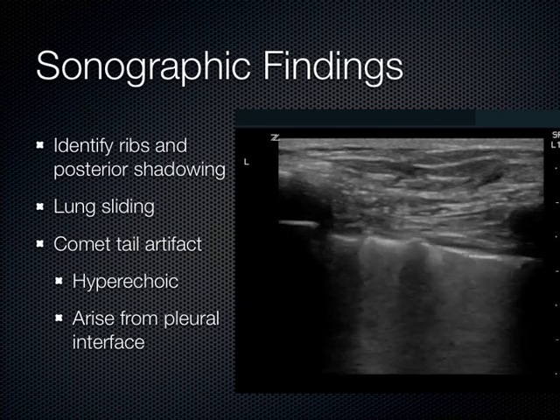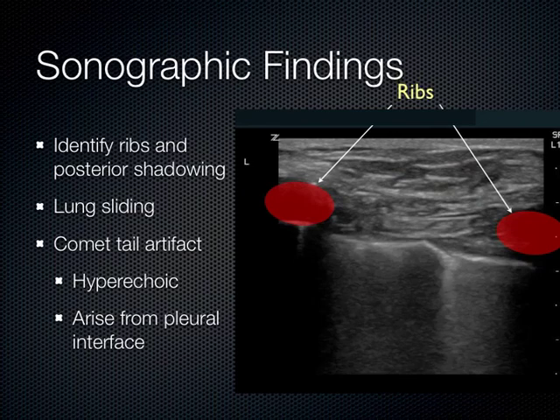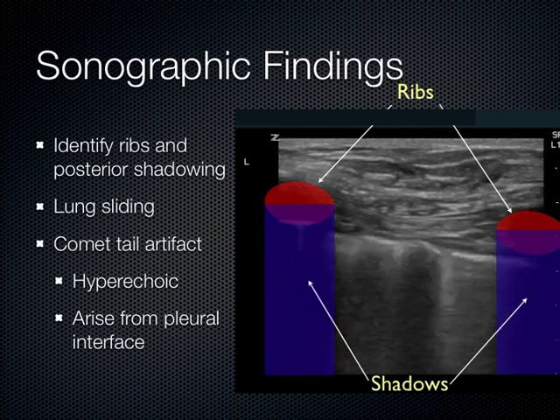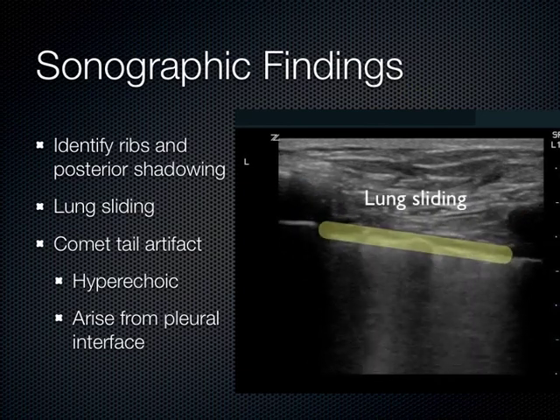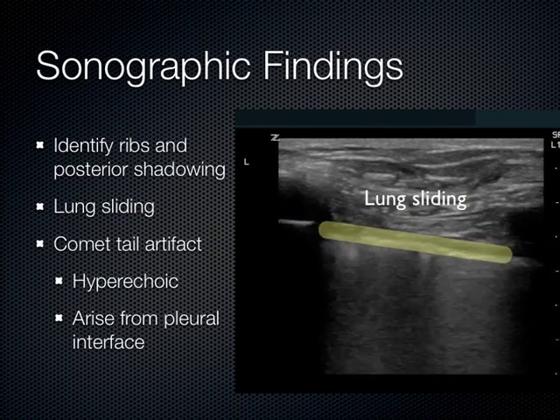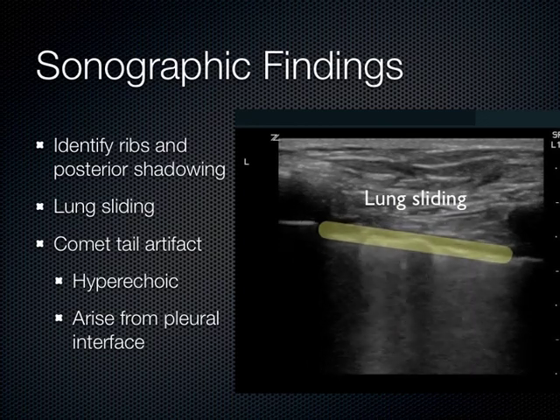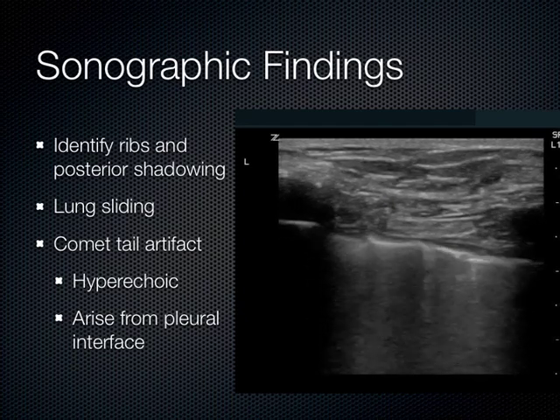And again, just in case we're not talking the same language, this is lung sliding with some B lines underneath. This means that your lung is up. It's basically the visceral and parietal pleura are touching each other, and you don't have a pneumothorax in that area where you're looking. Doesn't mean you don't have a pneumothorax somewhere else. You still have to be thorough and look at all the 8 quadrants, but it means at the place where you're looking, the lung is adhered to the chest wall.